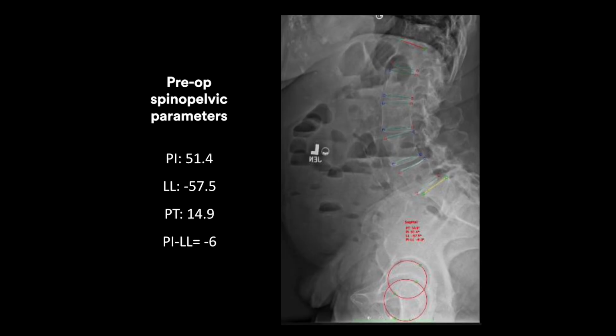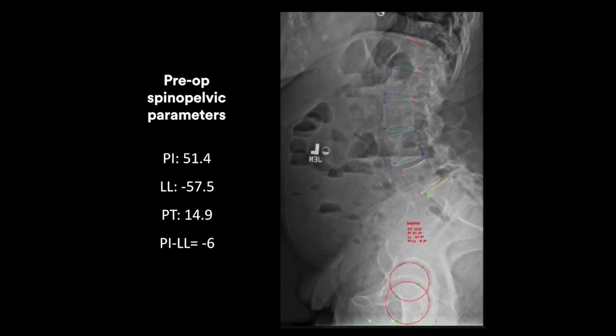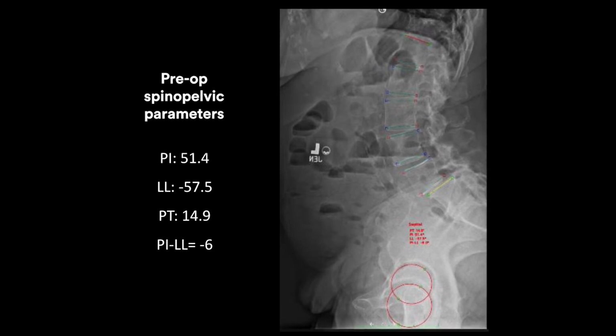In the past, what was the good solution here? Is it a tubular TLIF that you do over the course of several hours at each level, or do you take the time and the morbidity of a 2-level ALIF? Here are the spinopelvic parameters. She's not terribly malaligned, although you can tackle more severe sagittal malalignment with single position surgery. In our hands, this is exclusively a single position surgical case.